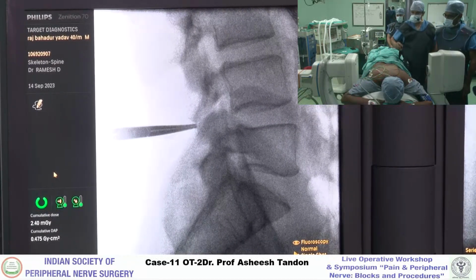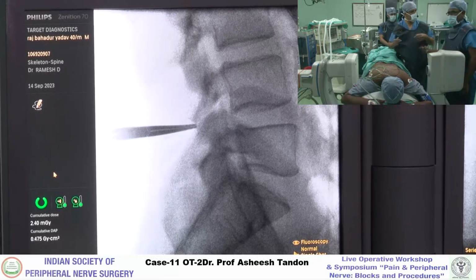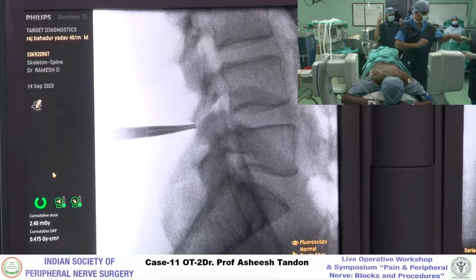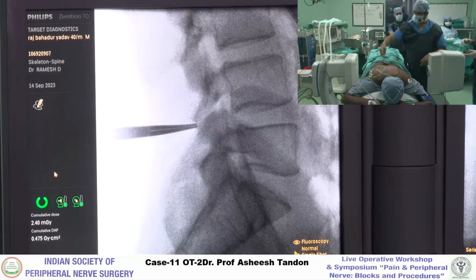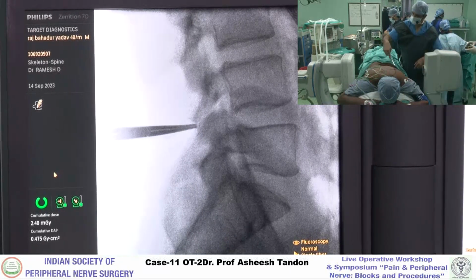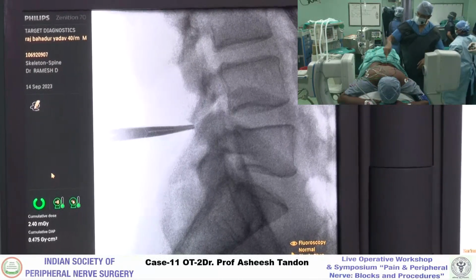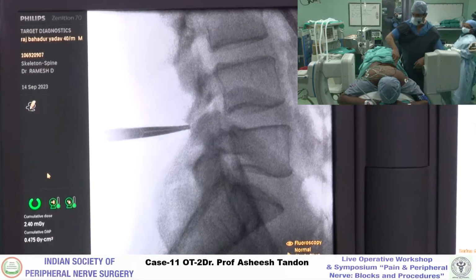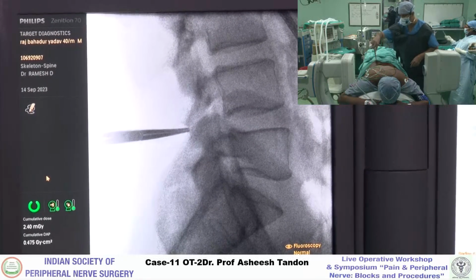Okay, local please. You scrub. Give it to me, I'll paint. They are cleaning this please. So till Ramesh is scrubbing, if there are any doubts, questions, I'll be more than happy to answer.